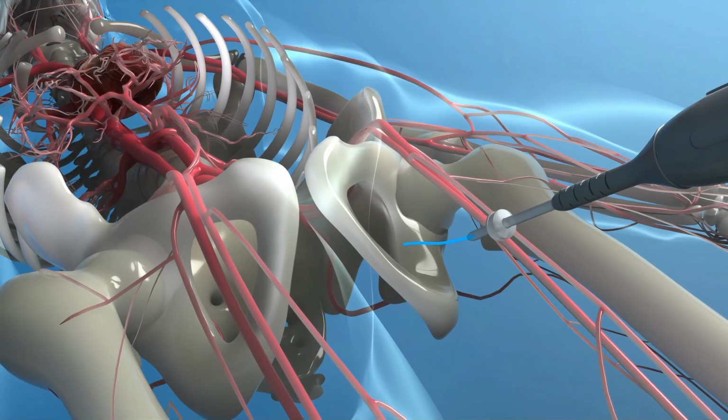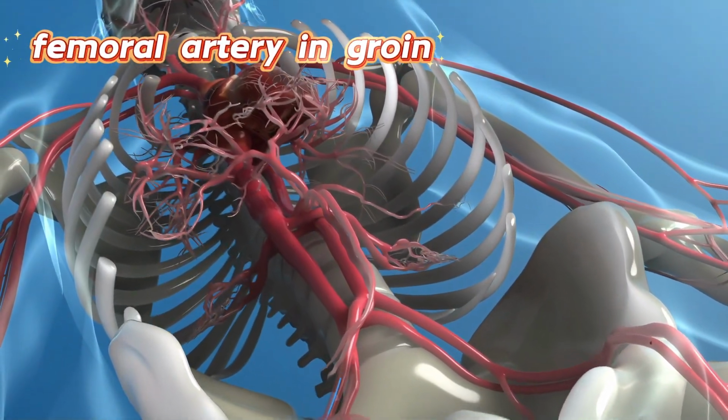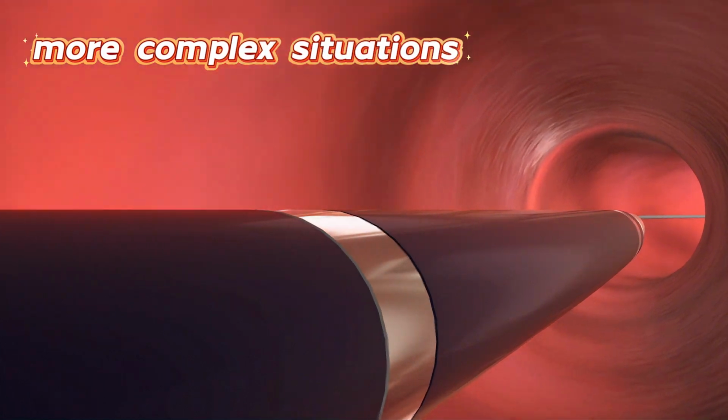If the wrist route isn't workable, doctors have another option. They go in through the femoral artery in your groin. This traditional highway is wider and is the preferred choice for more complex situations.